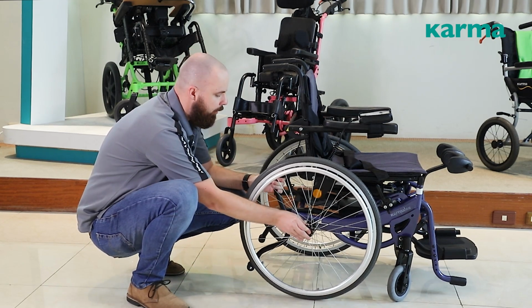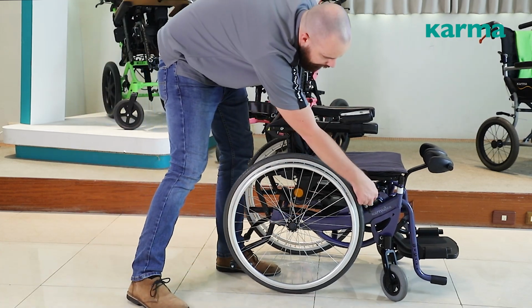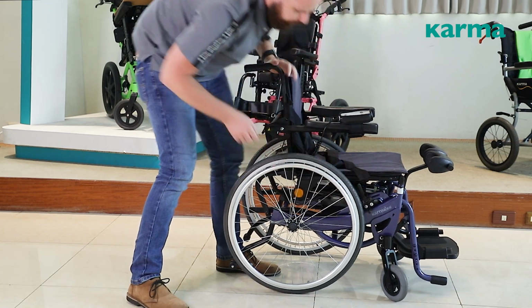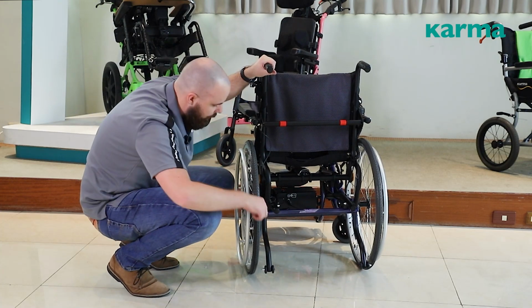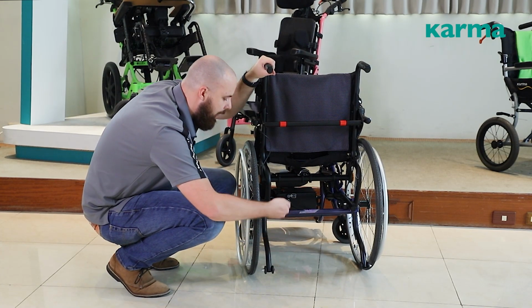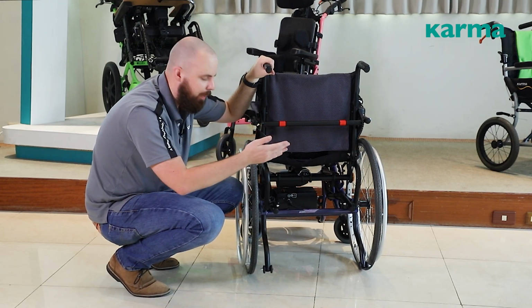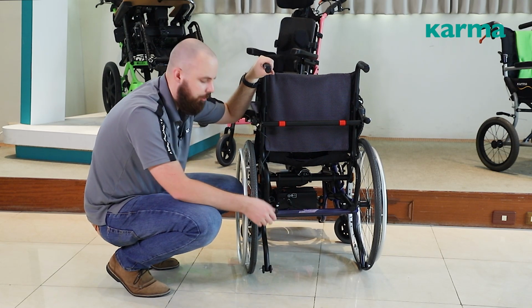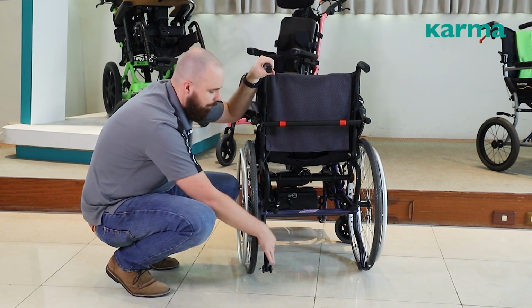Now, as we move the rear wheel forward and backwards, we can also adjust this brake along this rail here. So just a standard push to lock brake. And then we can also adjust the anti-tippers here. So there are 3 different height levels. Again, right now we're in the standard. We can move it up for a more active position, so that'll allow the chair to tilt back a little bit more. Or we can move it down for a more stable and secure position. So that'll decrease the distance and make the chair tip back just a little bit before these stop you.